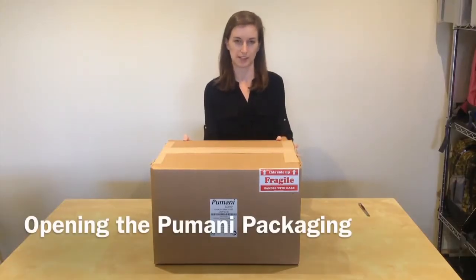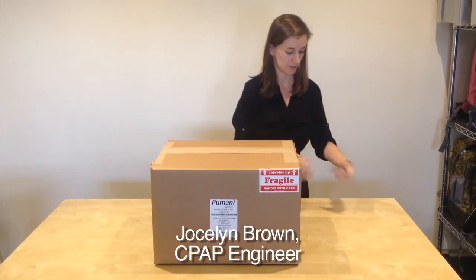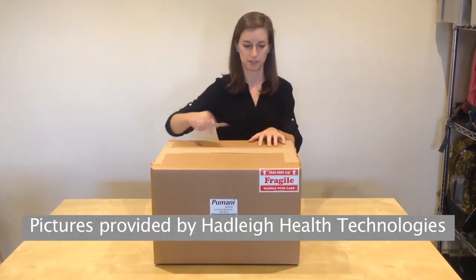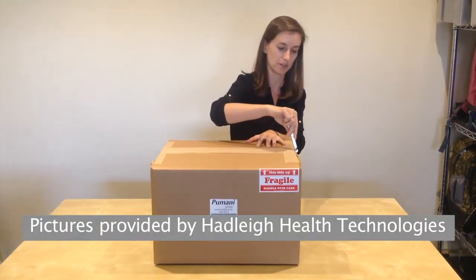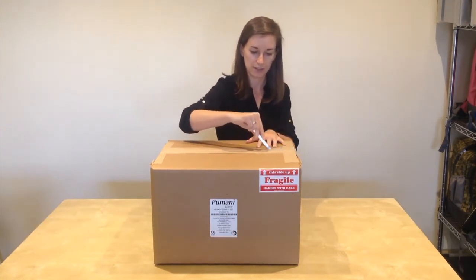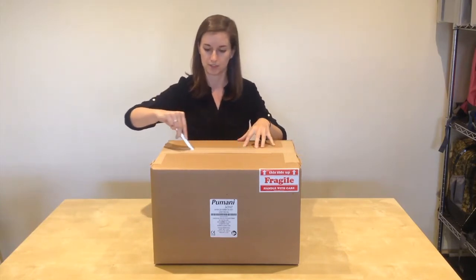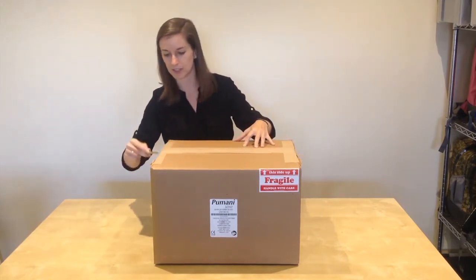You've now received your Pumani BCPAP package, so I'm going to open the package and explain all of the contents. Take a box cutter to open your box, and be careful not to cut in too deep, otherwise you may cut some of the components inside the box.